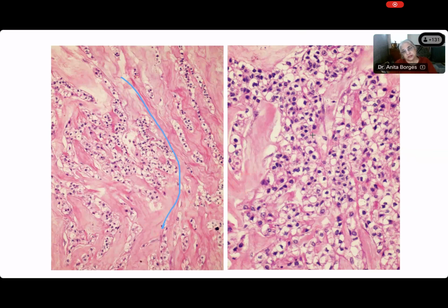Describe the cells. Nothing strikes you about the cells, Somik. These are clear looking cells. Ah, they're clear. Very good. Having clear cytoplasm. Very good. They're clear. And did you see the secretory carcinoma, Somik? We saw a secretory carcinoma a little while ago. Yes. And what did we say about the cells? That the cytoplasmic borders were indistinct. Now, in this case, can you tell me, Somik, what are the cytoplasmic borders like? These borders are distinct. Exactly. They are box-like. You can see every border of these cells. And they are clear cells. And what about the nuclei?